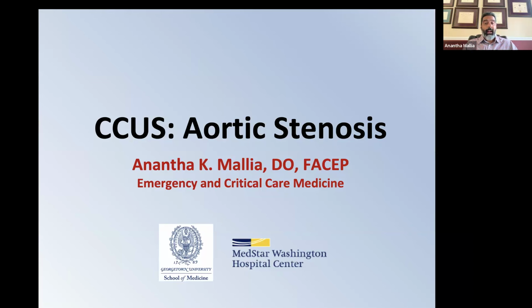And number two, the basic evaluation and monitoring of aortic stenosis really takes the knowledge and skills that you have already acquired with the previous material, just applying it in a different way. So it's very much within your wheelhouse to be able to identify this pathophysiology. And then once you identify it, then get the formal echo to confirm it and to get more formal measurements and evaluations.